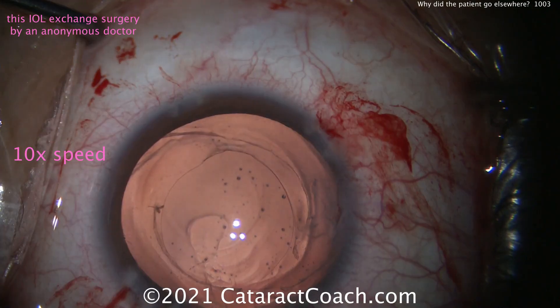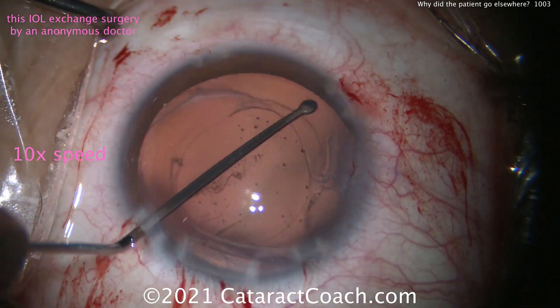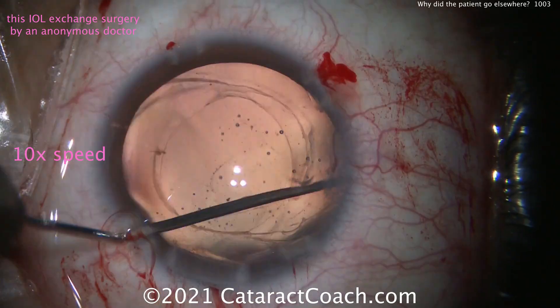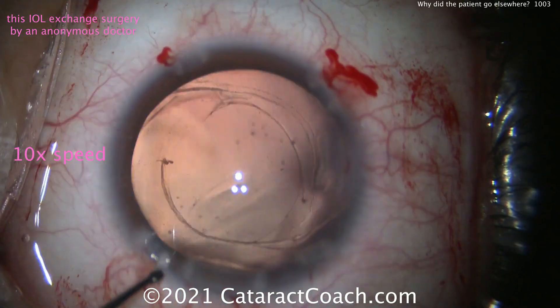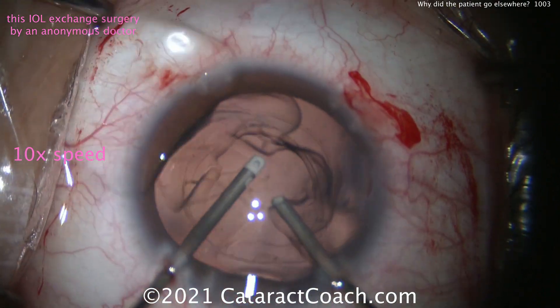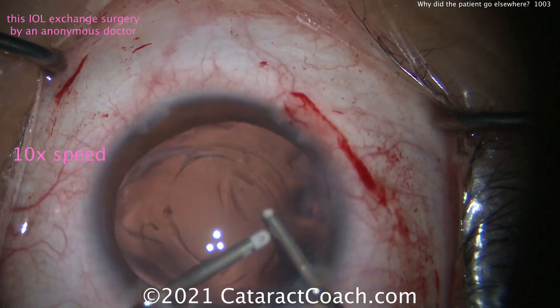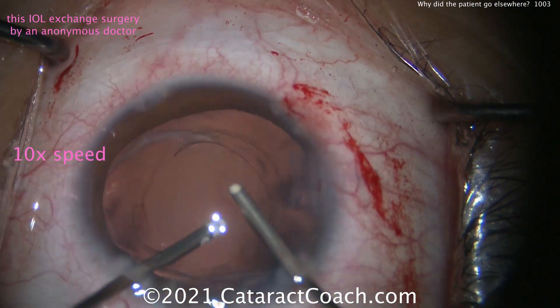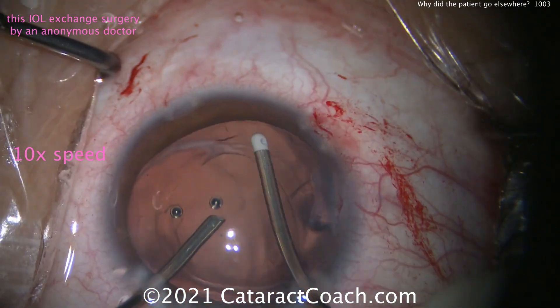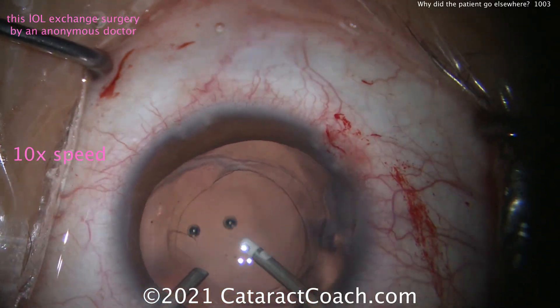He'll finish up this case by cleaning up that capsule bag and making sure it's open as much as possible. That's important because you want to really release the fusion of the anterior and posterior capsular leaflets from each other to have a big open bag. A little more irrigation-aspiration is being done here, cleaning up that capsular bag for whatever little tissue may be remaining. The new lens is going to be a three-piece silicone lens — that's the decision of this anonymous doctor in the community.